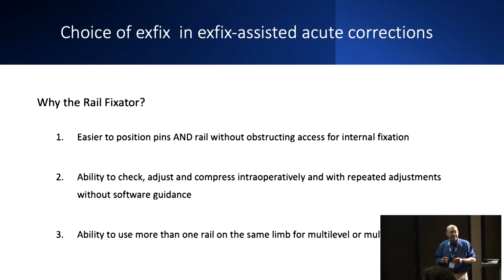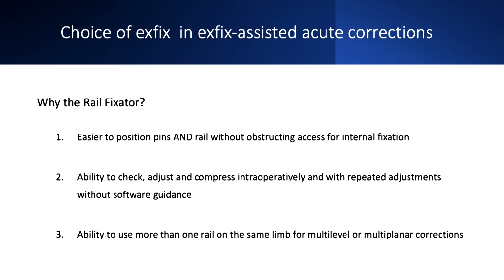Also important is I can tweak the fixator intraoperatively. Let's say I place my pins, as I view it, accurately. I do my osteotomy and I adjust my pins. Then I measure on my C-arm the angle that I've achieved, and I'm 4 degrees out. I do not need to go back to a software and enter parameters to tweak another 4, or to achieve a little bit of lengthening or a little bit more compression. I can tweak it simply as it is. And that is a big advantage, and it does speed up the process.